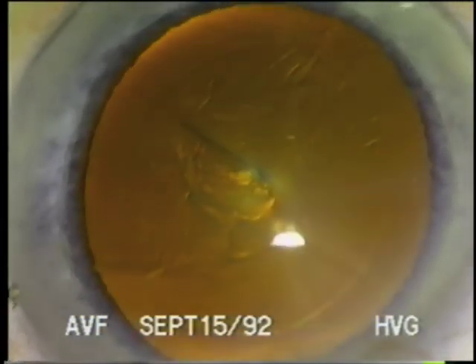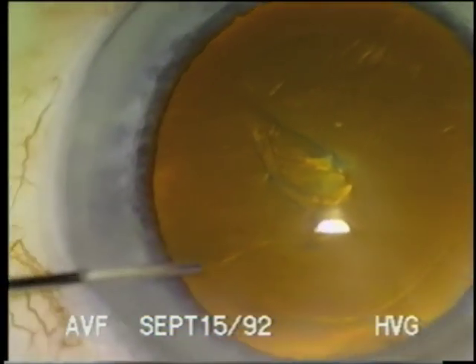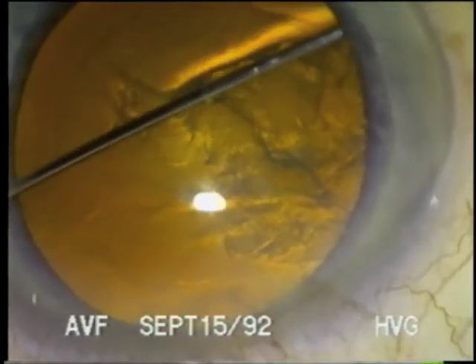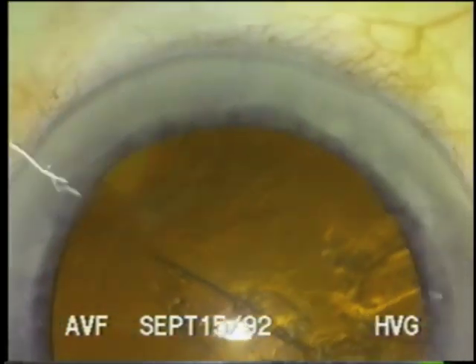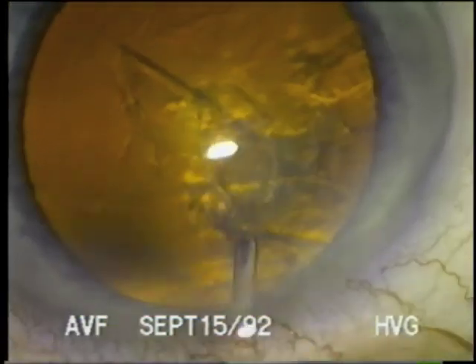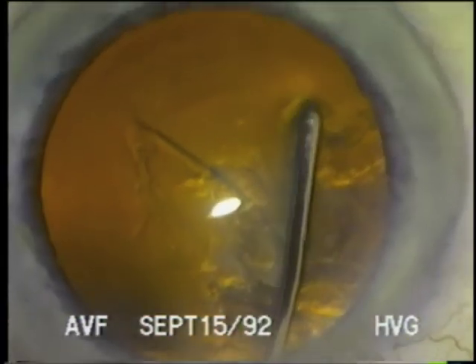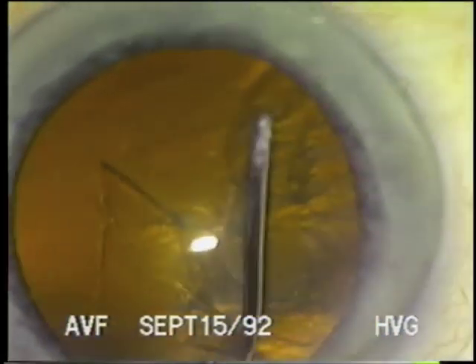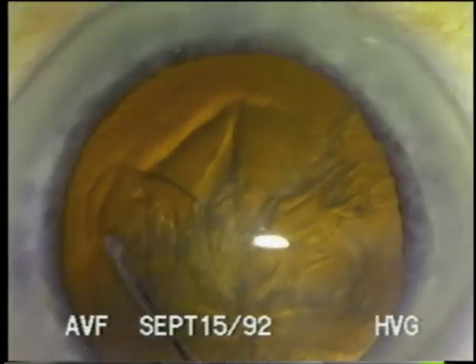Before beginning phacoemulsification, I routinely use hydrodissection, starting first with hydro-free dissection, lifting the capsule without irrigation, extending as far as can be reached to manually separate the anterior capsule from the cortex. This is followed by injecting a fluid wave posteriorly, causing hydrodissection between the cortex and capsule.